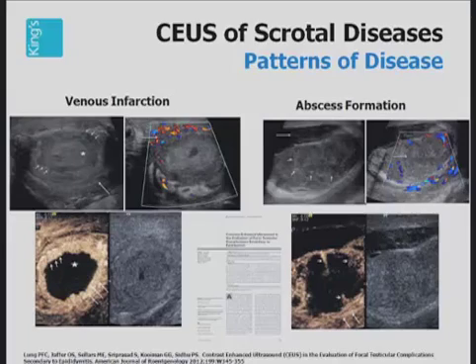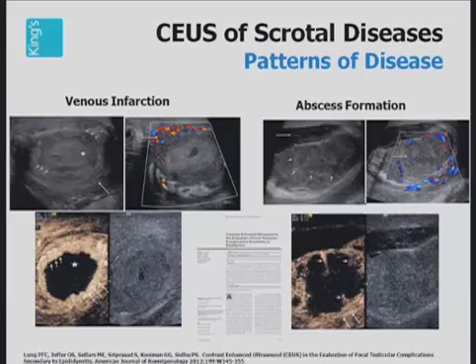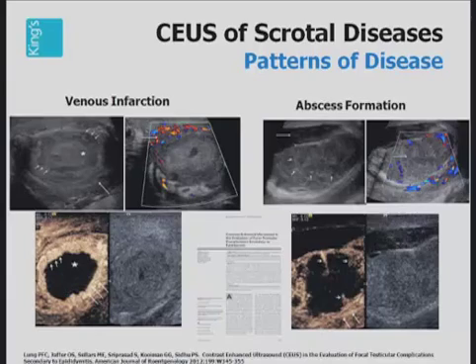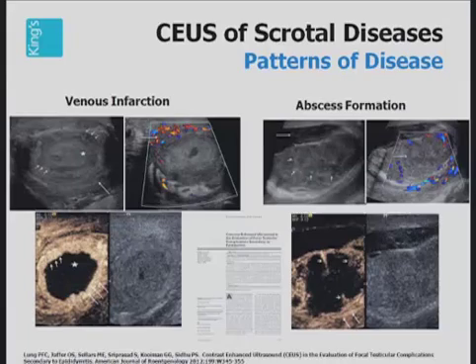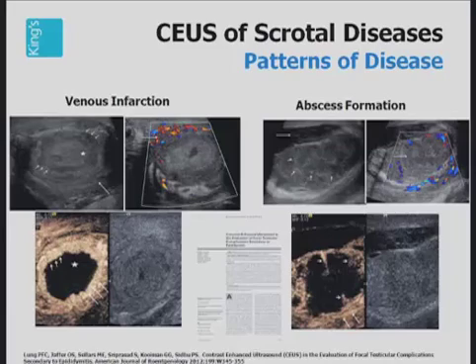The second patient has very severe epididymitis but has also developed an abscess within the testes. The abscess is very different from the venous infarction. The walls of the abscess are irregular and septations are forming across the abscess. This is again very clearly demonstrated with contrast-enhanced ultrasound.